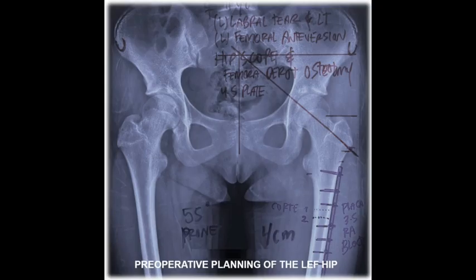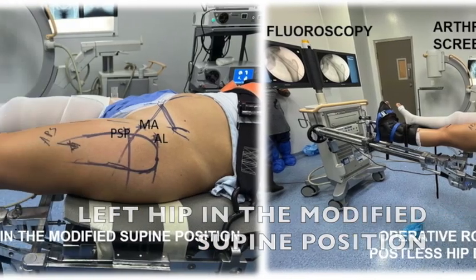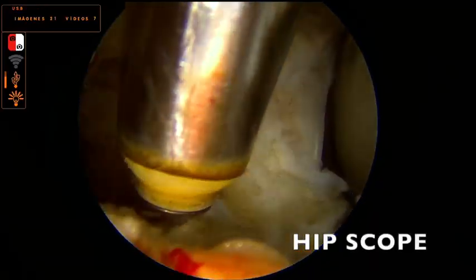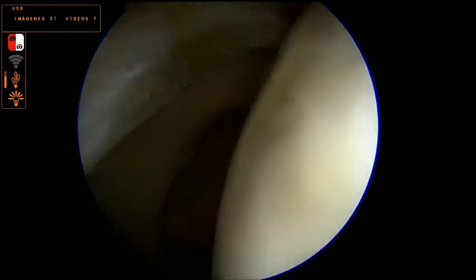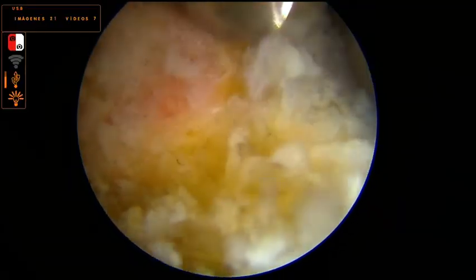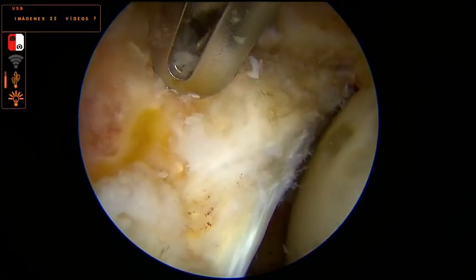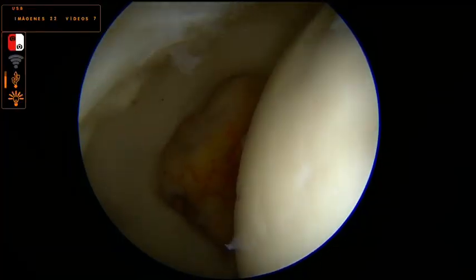Note how the osteotomy site is marked and a 4.5 locking compression plate is planned to fix the osteotomy. The following images show how the patient is positioned preoperatively. Note the use of a postless hip distractor. The following video shows the hip scope of the patient, in which a labral tear was confirmed. The labrum was repaired using 2.8 knotless anchors and a 1.8 anchor for the anterior labrum.